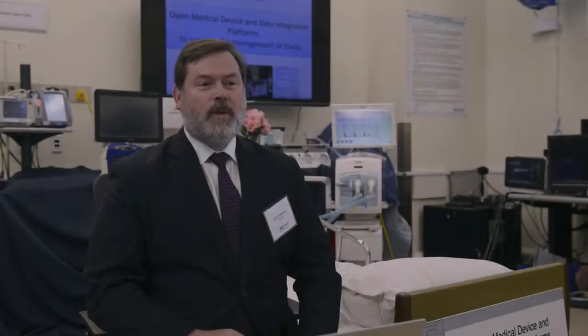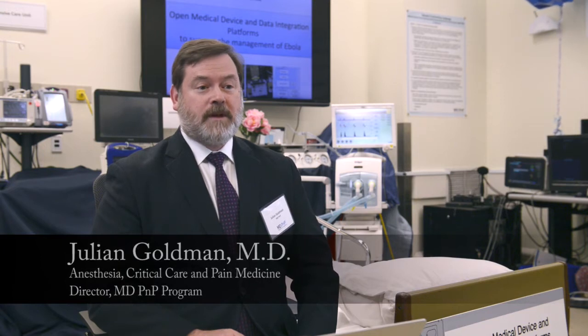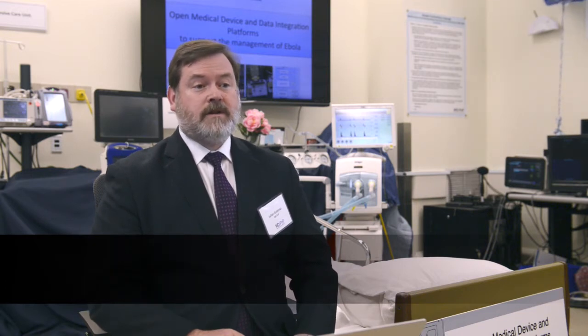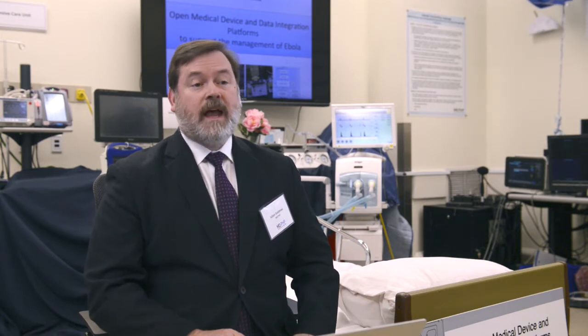Welcome to our lab where, with a group of collaborators, we at the Medical Device Interoperability Program at Mass General Hospital will be showcasing ideas and prototypes for how we as a nation may improve the quality of care for Ebola patients and their caregivers. What we're going to show today will be a workflow all the way from the monitoring of individuals who may have been exposed to Ebola, to those who show signs of sickness or illness from Ebola, to their care in the hospital, all the way to their discharge.